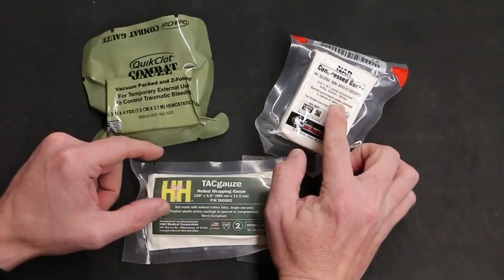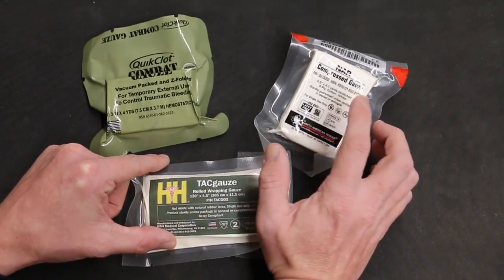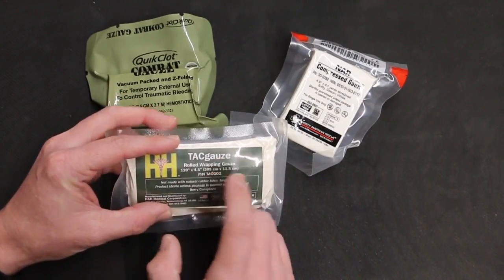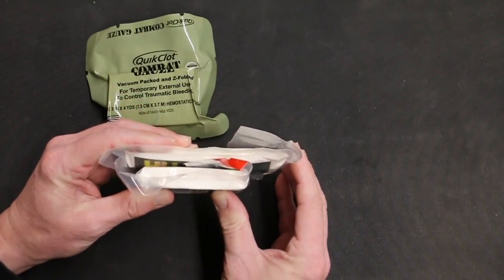To show you a little bit of comparison, this is the NAR compressed gauze. You're getting 4.1 yards, which is right at 12 feet, with the NAR. And then you've got 120 inches — about 10 feet — with the TAC Gauze. So you do get a little bit of difference in size comparison here.